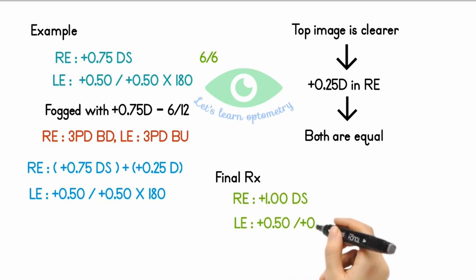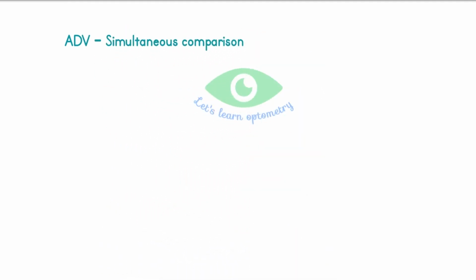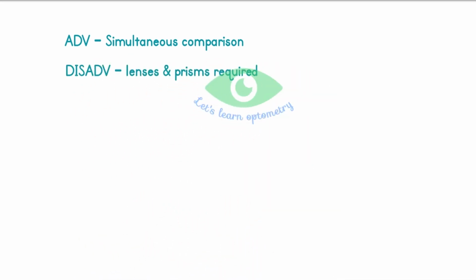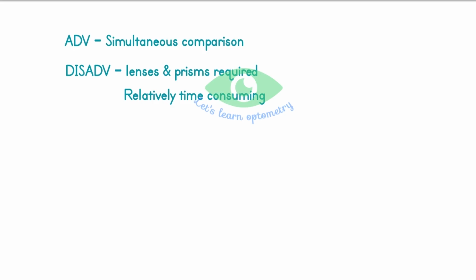The advantage of this test is patient sees both images simultaneously and it is easier to compare the clarity of both images. But it requires additional prisms and lenses and it is a little bit more time consuming than the alternate occlusion method.